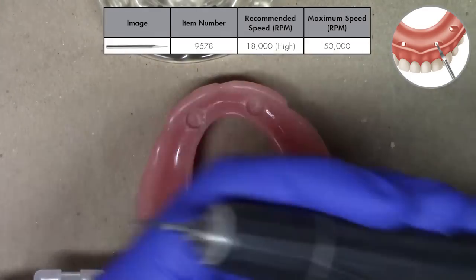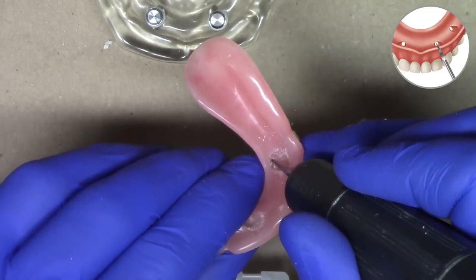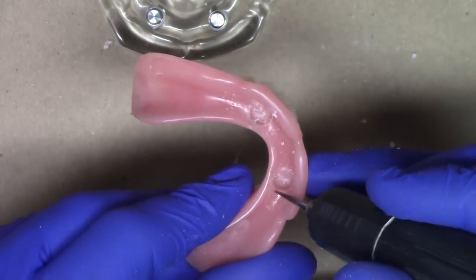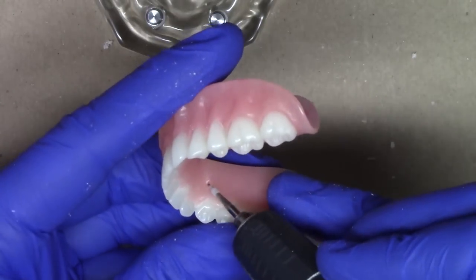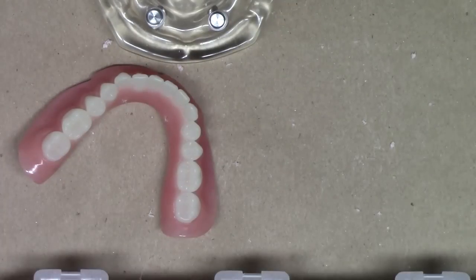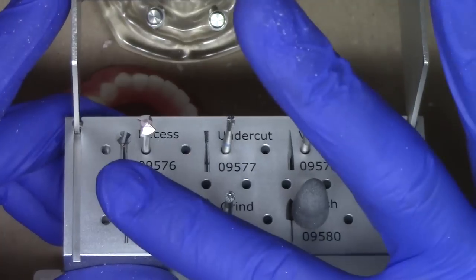Now I'm going to use the vent hole burr, also used on high speed. Starting from the intaglio surface of the complete denture, I'm going to direct the burr right at the junction of the superior wall and also the lingual or palatal wall, inserting straight through in a gentle forward motion. Sometimes we have to clean it out a little bit coming in this direction and also that direction, which really makes for a nice clean vent hole. At this point, we put our burr block down, because we've completed using the recess, undercut, and vent hole preparation burrs. We'll come back to the trim, grind, and polish burr once we have processed our locator attachments.